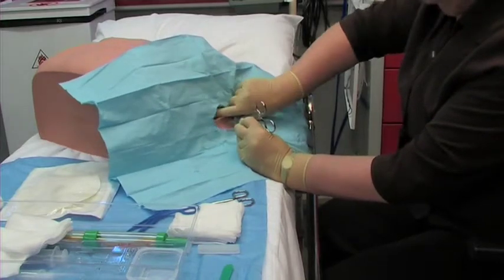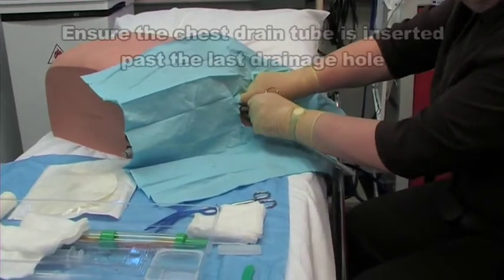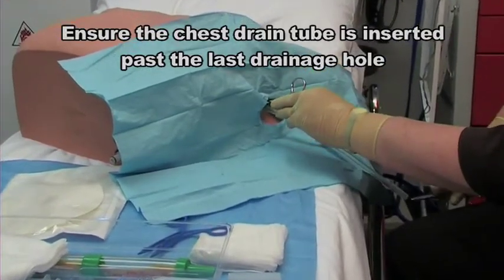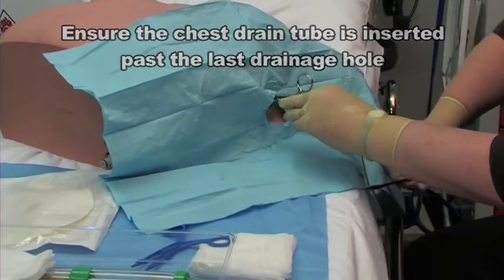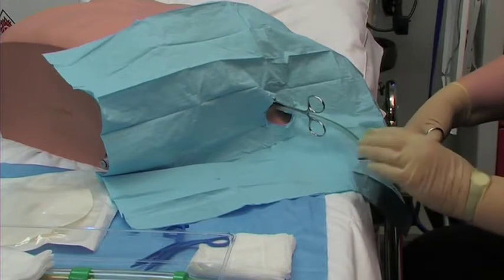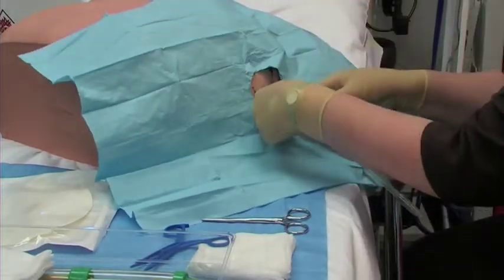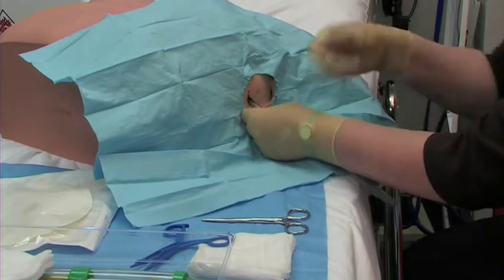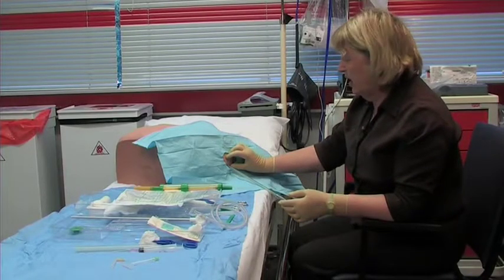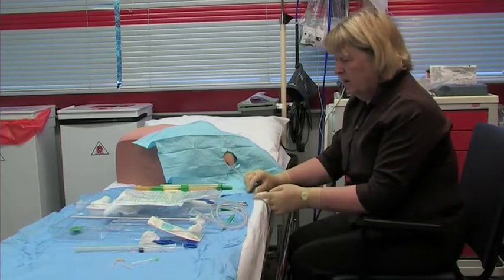Pop your finger back into the space that you've created and use that as a guide to insert the chest drain. You can, if you want, clamp off the bottom of this whilst you insert the chest drain — it's useful if there's fluid, but less important if it's purely air. Once we have this in place, we can remove the forceps. The next step is to attach the chest drain to the wall and attach a bag to the end of the drain.